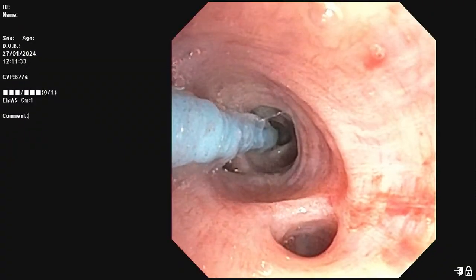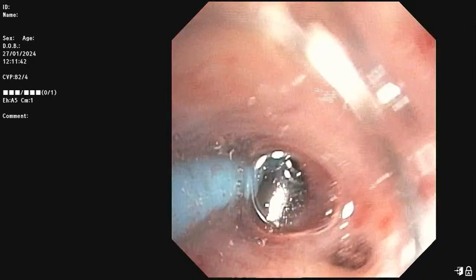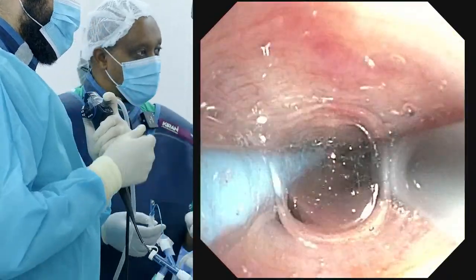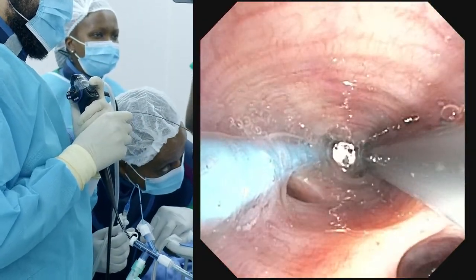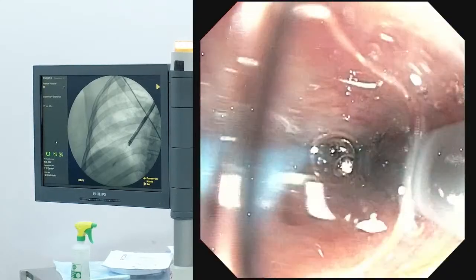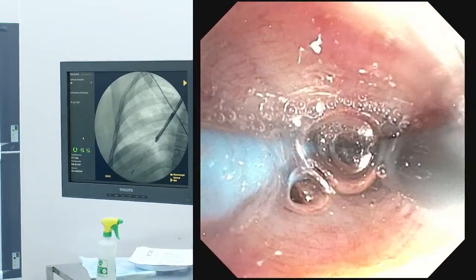Okay, good. Cryoprobe. Again, it tends to be a little bit of a squeeze in here, but we work it out. You're using a 1.7 probe going in. There you go. As you see, it's posterior. That's why it looks like this, because I'm not in the diaphragm, as you might imagine. That's why we use two techniques. One is we feel where it is, so that's the end of the probe right there, and then I'm going to pull it back about 2 centimeters.